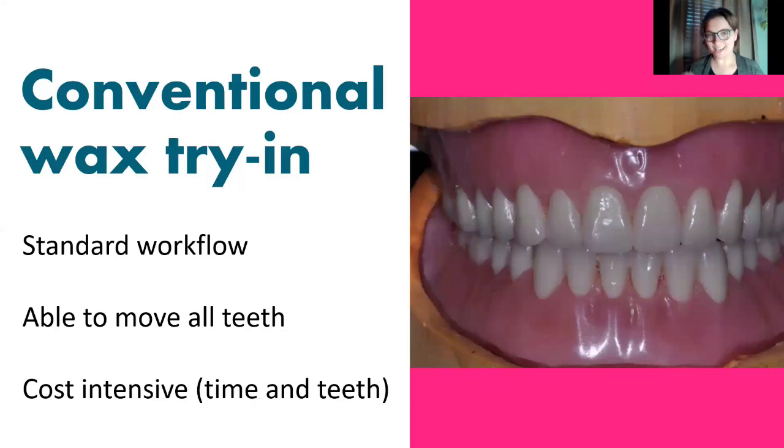You certainly can do a conventional wax tooth try-in, scan that in and print or mill a denture base, or just scan it and preserve a copy of your wax tooth try-in. So if the patient loses their denture, you can always repeat that without having to go through all the steps again. The biggest downside, of course, is the cost associated with this.